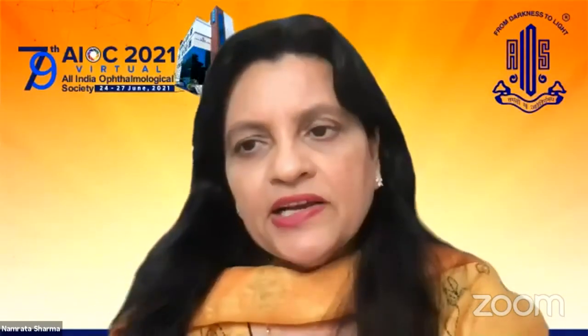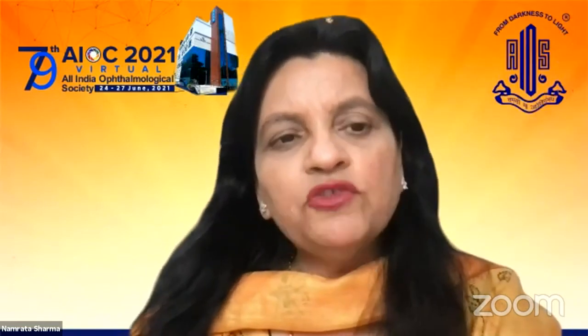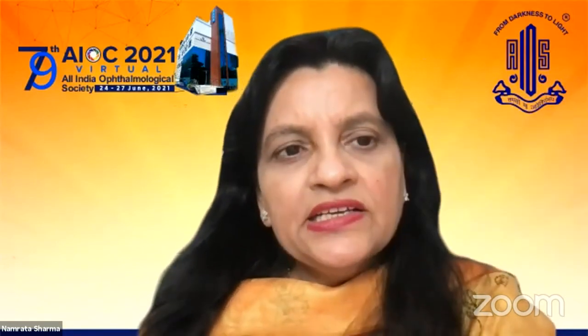Apart from the energy, it is also the thickness of the tissue, and I think the paper is nearer to the endothelium. Yeah, that paper is already published, where they don't use the same amount of energy but titrate the energy as per the thickness of the cornea. I think Dr. Hafizi published that paper very recently, last month. So you don't have to have 400 microns at the bottom. It can be 300, but your energy will change. The total energy delivered we can reduce by adjusting the time. If your machine doesn't allow setting 5.4, for example, then just cut off a few minutes before you take off the patient.